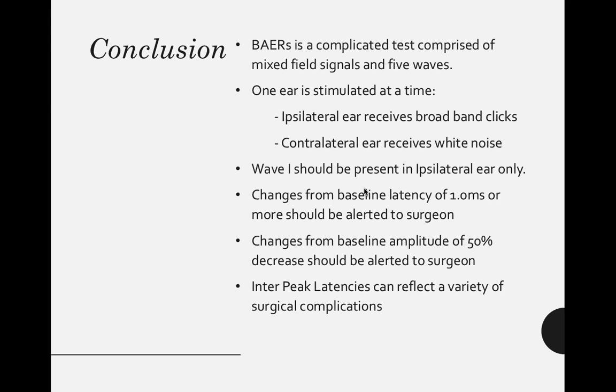You can't have both ears getting the clicks because then you can't be sure that you are testing the individual auditory pathways. Because these auditory pathways cross over and radiate out, you cannot have sound contamination from one ear bleeding into the other ear and potentially causing false positive readings.